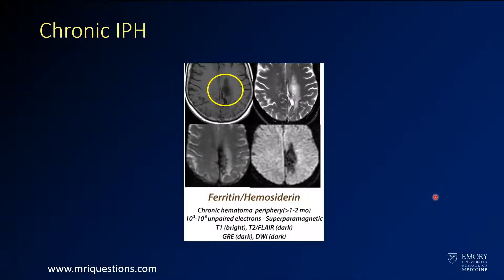Finally, as it becomes chronic, you're going to see something that's dark on almost all sequences — just ferritin, which doesn't have a lot of signal and is dark on most sequences. You see a little bit of darkness on T2, although you do have some gliosis around it. It's dark on diffusion and gradient imaging as well.